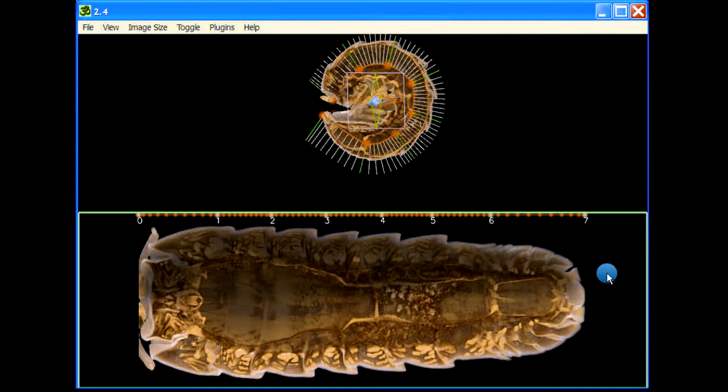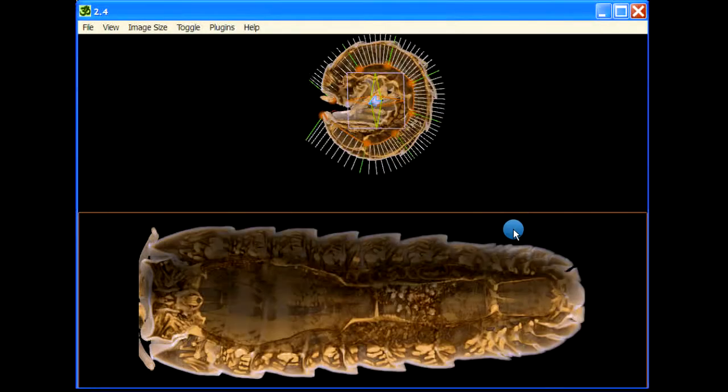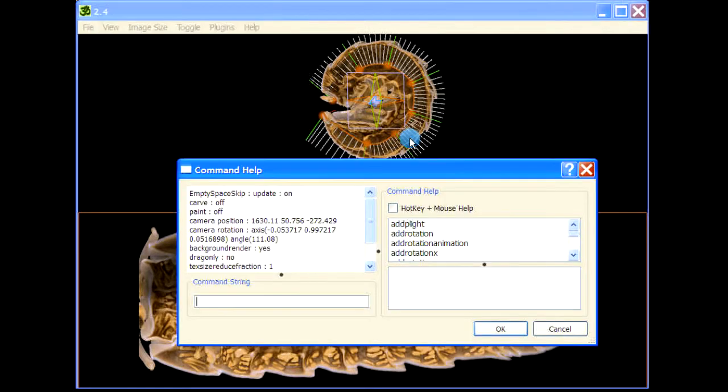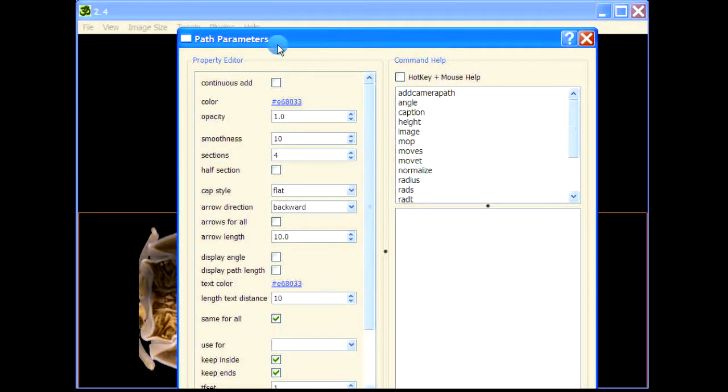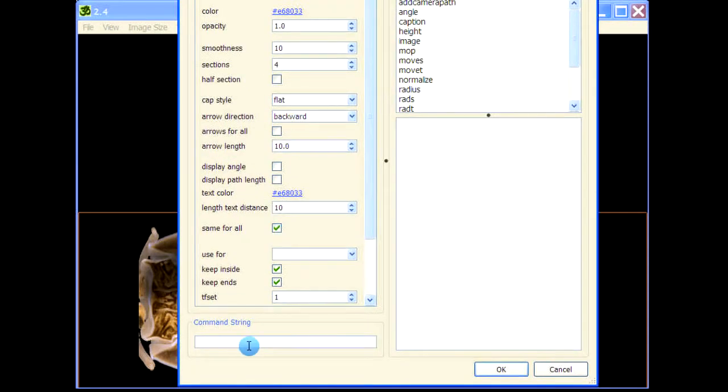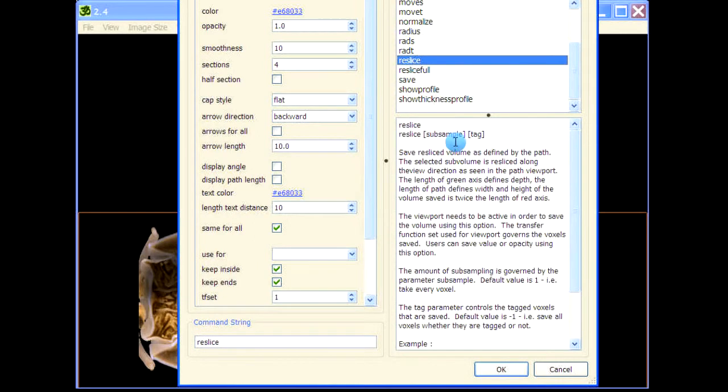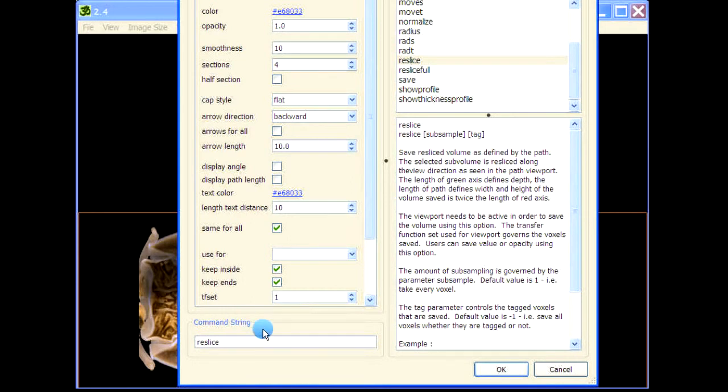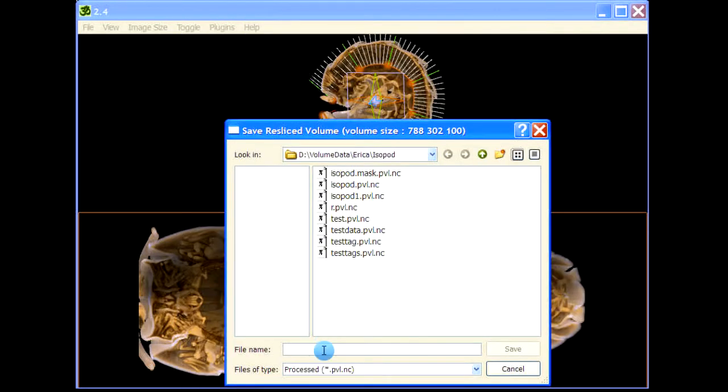Let's now save this using reslice. Press spacebar and we'll get path parameters because my cursor was in the viewport. If my cursor was here then I would get the command help normal. So press spacebar, path parameters, and then reslice. Let me also show you the help here. Reslice parameters are very similar to the one you get for the clipping plane as well as for the whole volume. Reslice, and then say part one.